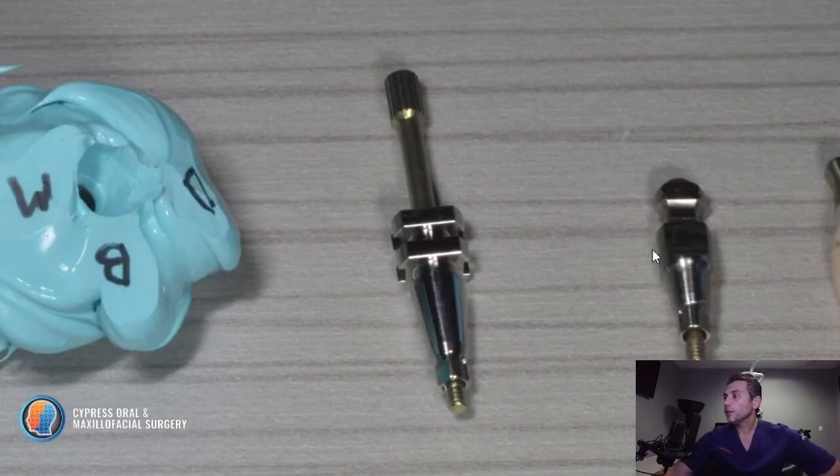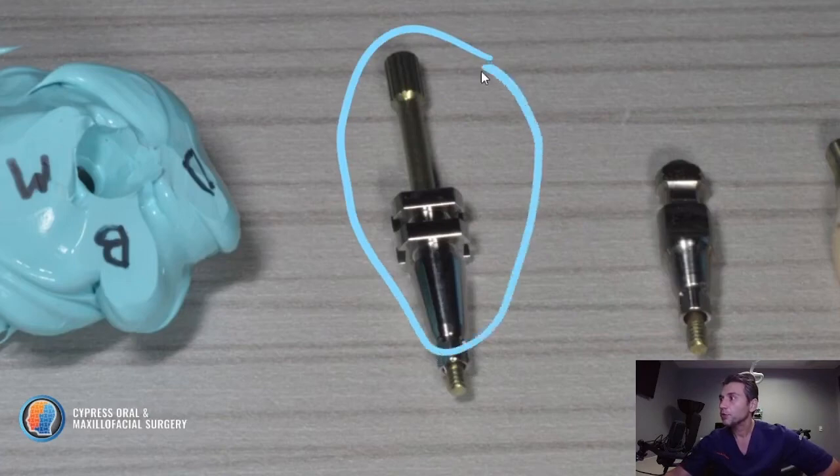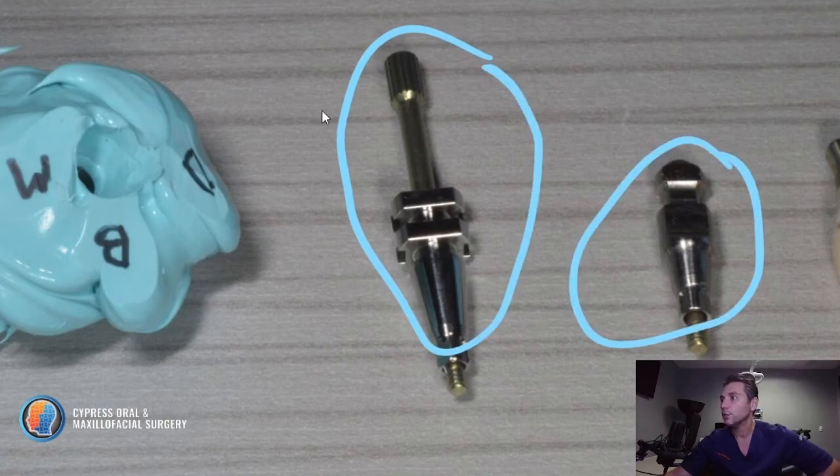What I end up using here is an open tray impression coping. I feel like open tray gives the laboratory more information. It's more accurate. It doesn't move. This is what the open tray impression coping looks like, and this is what the closed tray looks like. You can use a closed tray as well, but in this case I opted for the open tray. And what you do is you take this and you screw it in here. Again, not very tight. Just finger tight, very loose.